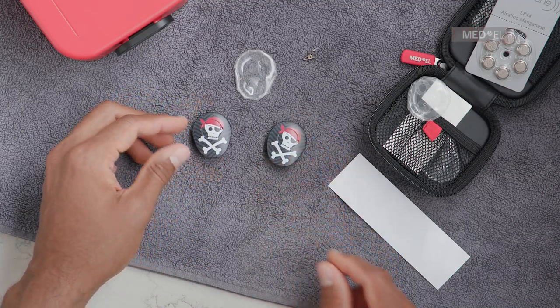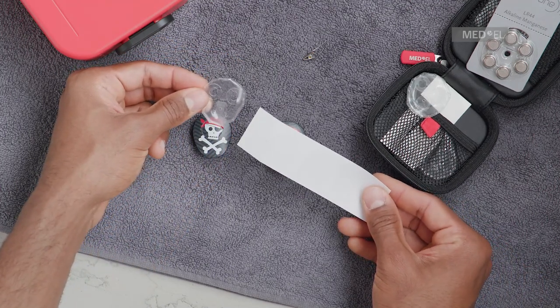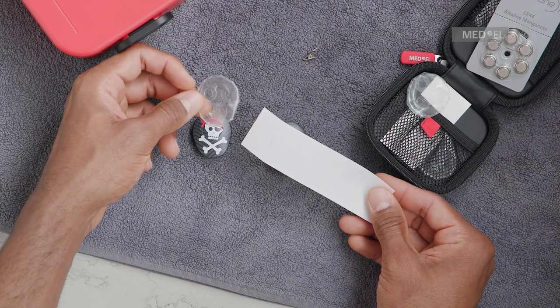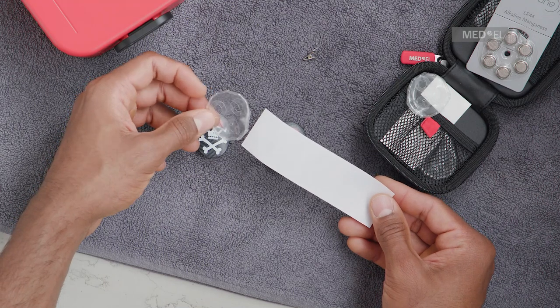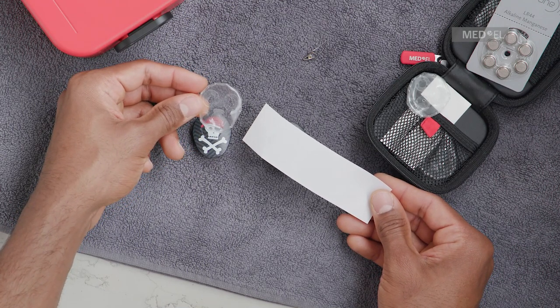Waterwear is a cover for the Samba 2 audio processor that provides complete water protection for activities such as swimming. It consists of a skin and an adhesive seal tape. You can use each skin up to three times, but the adhesive seal tape needs to be replaced after each use.